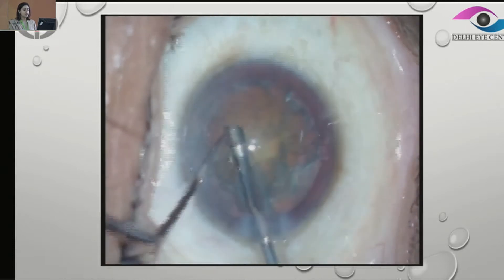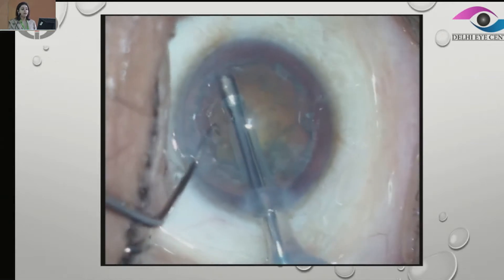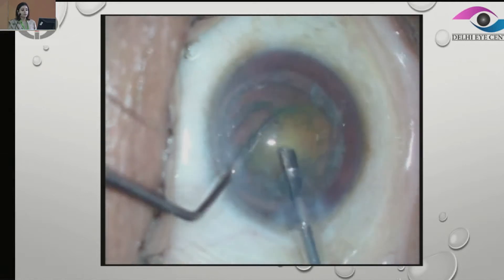Again, we are going ahead removing the epinuclear plate, and then we can just use the chopper — we can actually prolapse the whole nucleus. Here we are just using the chopper, and now that the nucleus is freed from the sticky epinucleus.